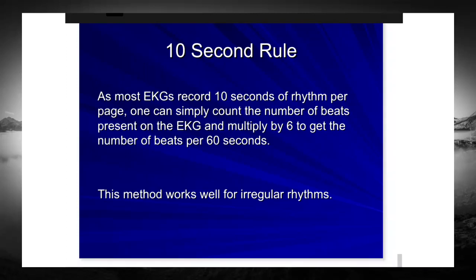10 seconds, right? And what do we say the QRS is? Which is another name for saying the pulse, right? Every time the heart contracts, that's the pulse. It had to depolarize in order to contract. So that QRS is the depolarization of the heart, which means the heart just contracted, which means if I had my finger on their pulse, I would have felt the pulse. So all I have to do is count the QRSs, know how long that strip is, and then multiply, if it's 10 seconds, by 6, and there's the heart rate.